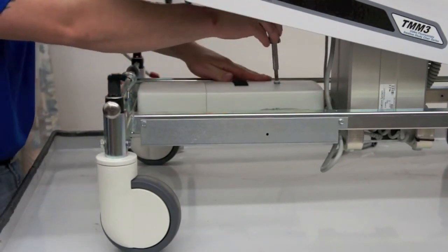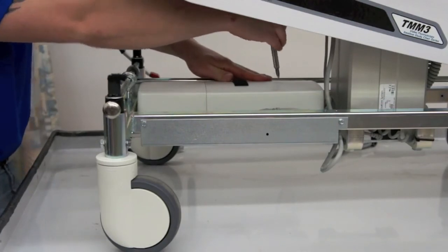Using your flat head screwdriver, push down on the cover and turn the screw to the locking position.